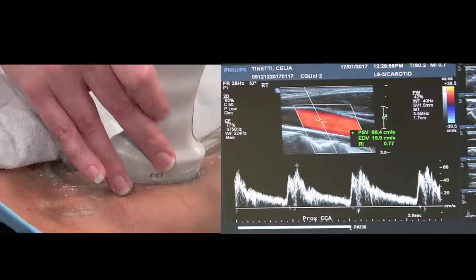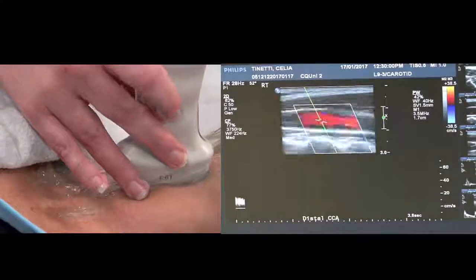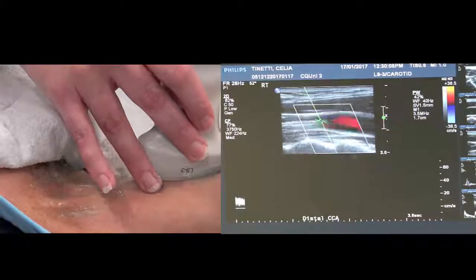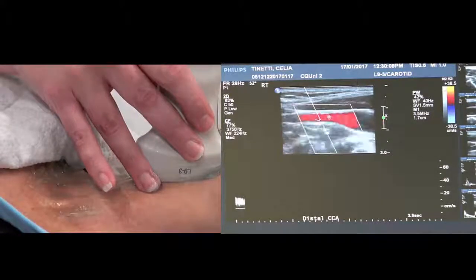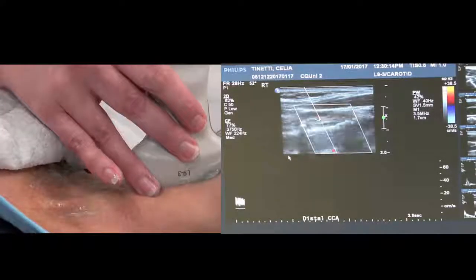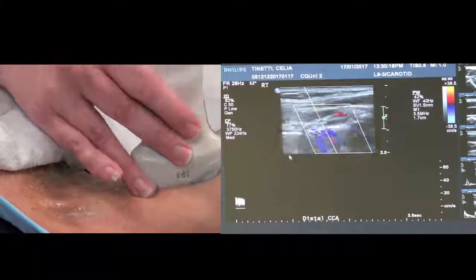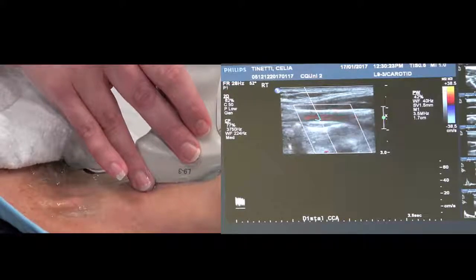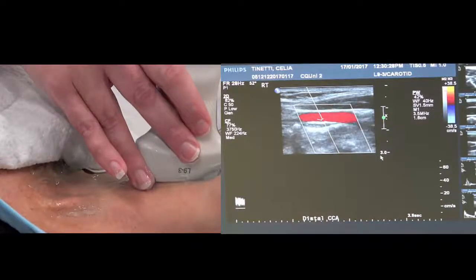So you get the highest point — the point before the notch — distal. Remember you're angling the probe now, so you need to work out which approach suits you. Everyone's different. Some people's ECA comes right up and some drop down quickly. You need to work out which way's more comfortable for your hand and which way's more comfortable for your patient — you don't want to be heel-toeing right into their neck. For the ECA, where you would think you need to drop that depth a bit — you can't, it's 3cm.